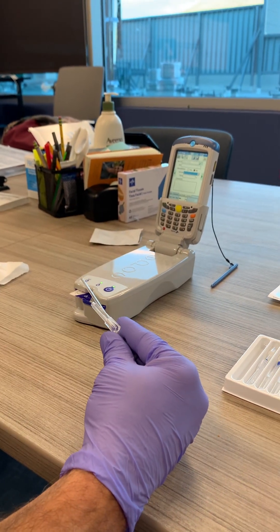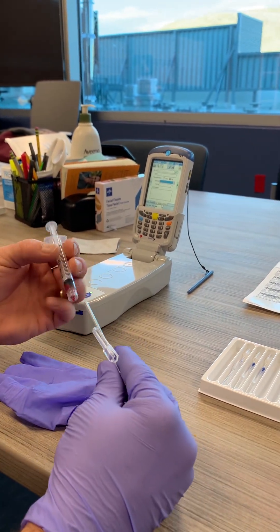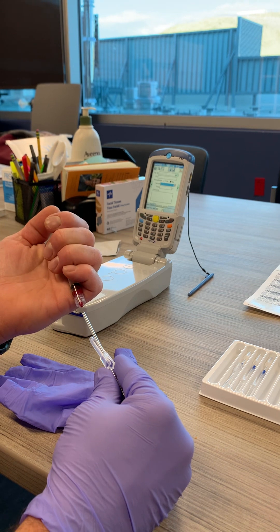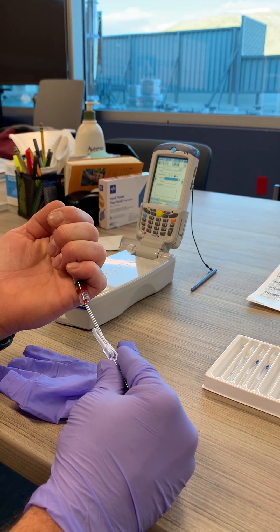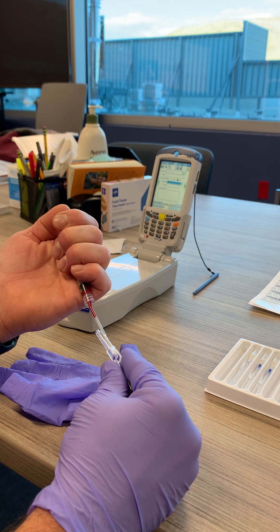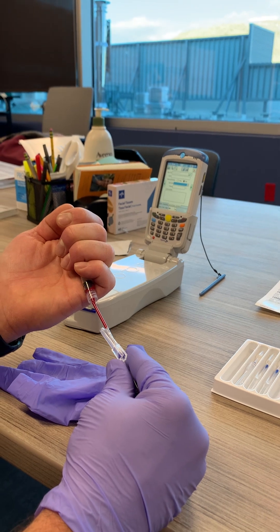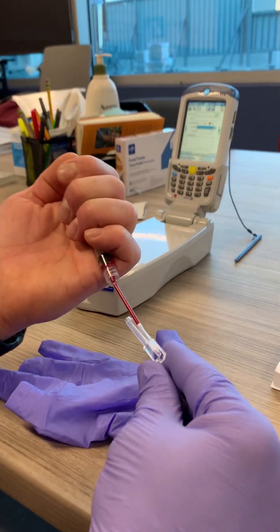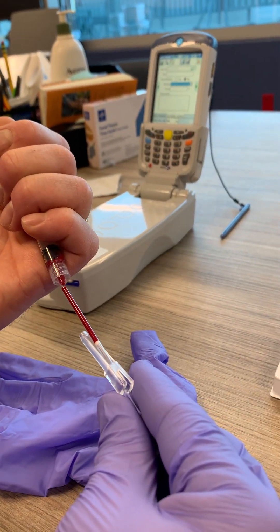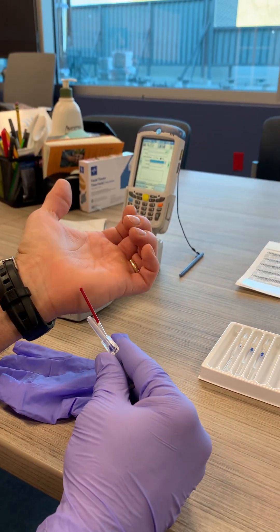We're going to go ahead and introduce some blood here. We're going to pretend we're getting this from a heel — so we'll fill it, pretend this is coming from a heel. In a heel stick example, you'll see it's going to get to the white marker there and then you'll be full. If we were coming off of a heel right there, it would look like that.